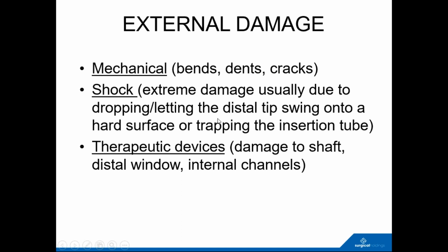a distal tip swinging and hitting a hard surface, or where it's put into a container for transport or storage, it may be trapping the insertion tube in that container. And as there are a growing number of therapeutic devices through the instrument, there can be damage to the internal channels particularly, or the distal part of the scope from a laser, for example. A good example, I think, of that would be the flexible ureteroscope that I just showed.